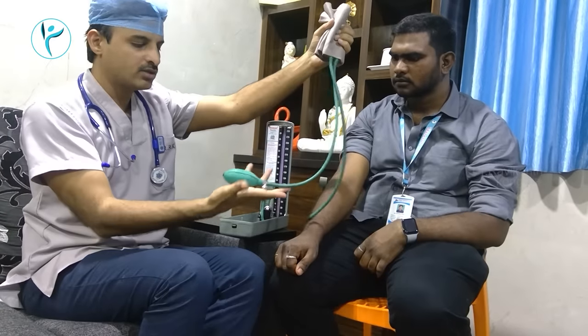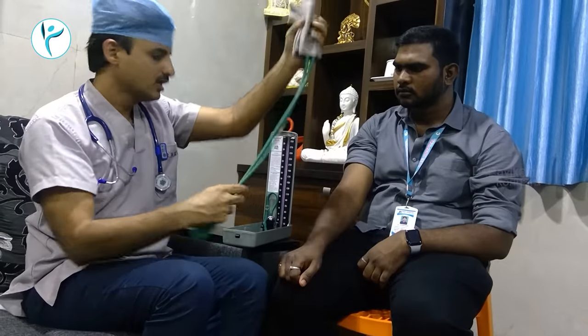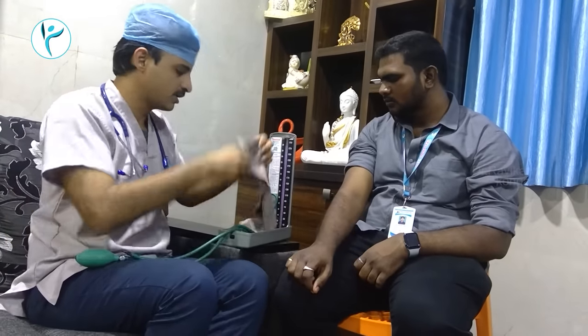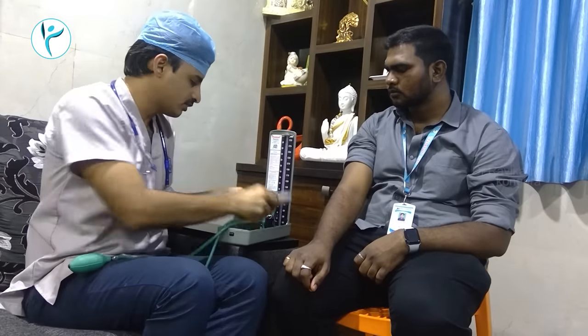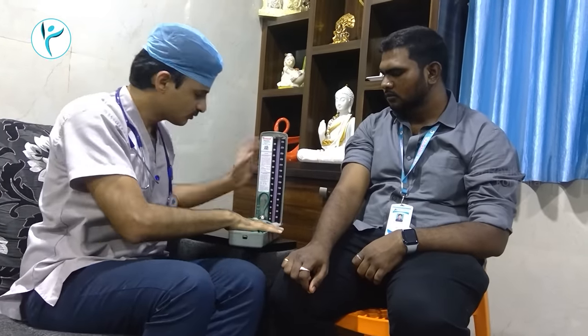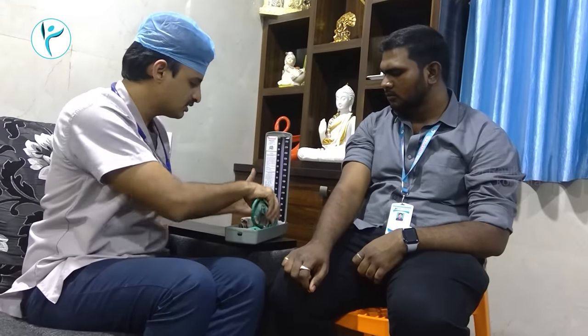Now we have to look at the cuff of the BP machine. This is the cuff of the BP machine.